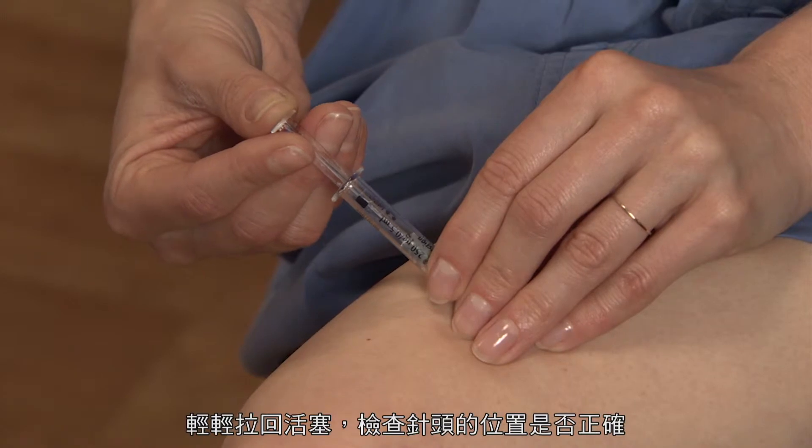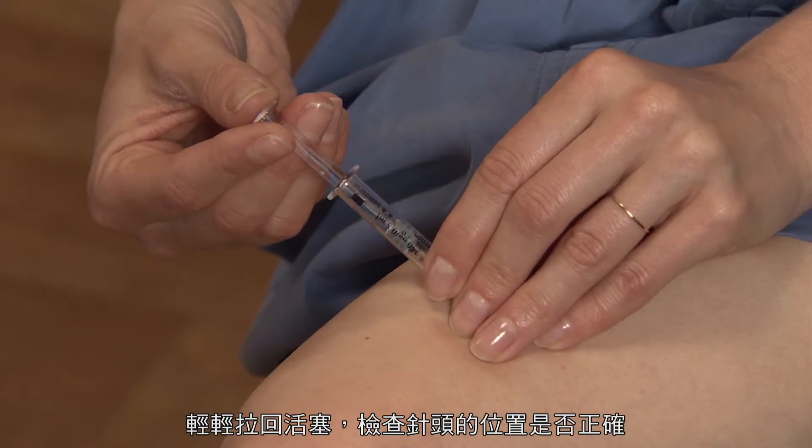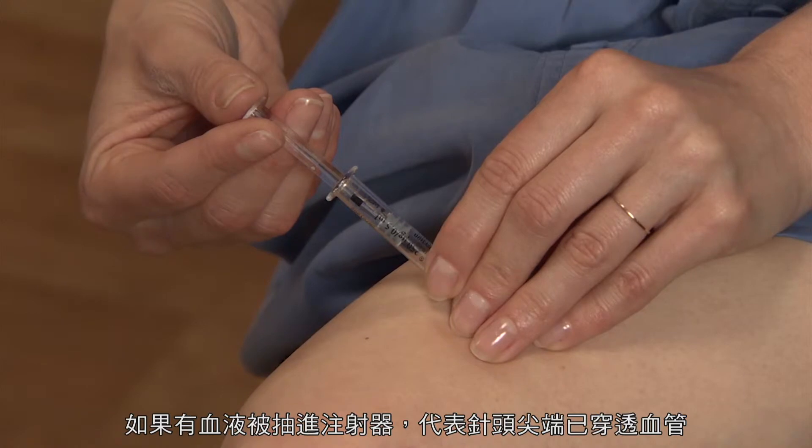Gently draw back the plunger to check if the needle is positioned correctly. Any blood drawn into the syringe means the needle tip has penetrated a blood vessel.